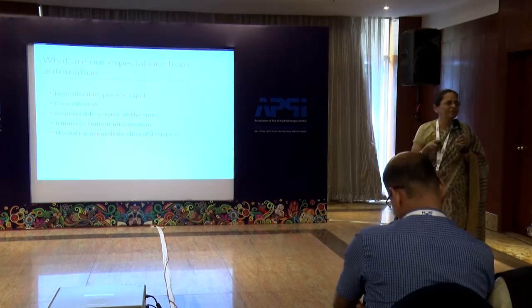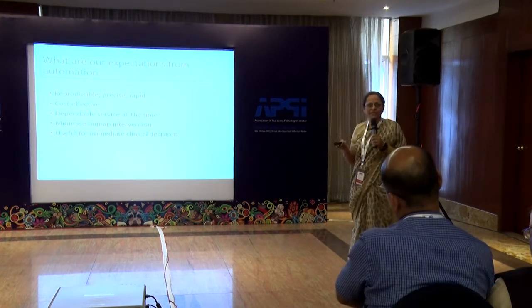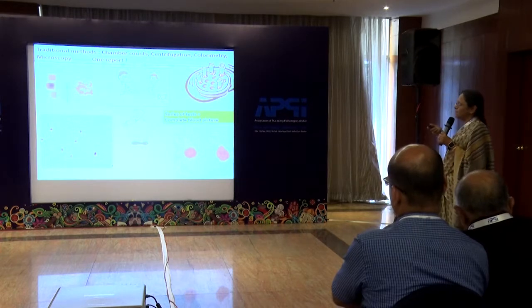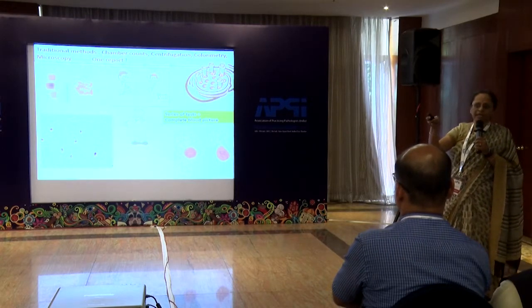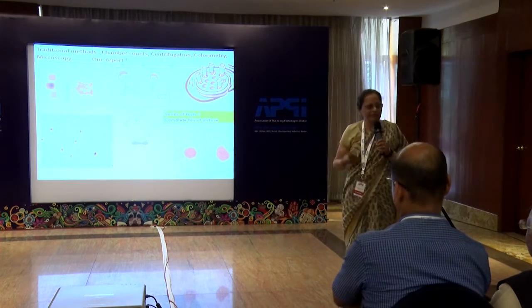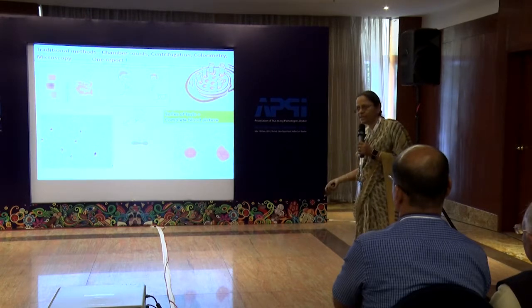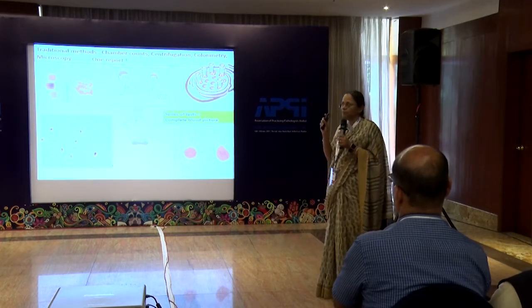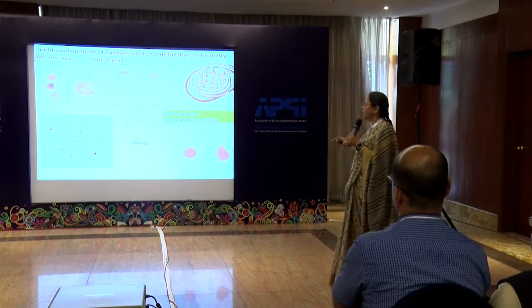We are trying increasingly to minimize human intervention because of several factors involving manpower. So these are the expectations that we have from the laboratory when we have automated cell counting. The traditional methods had several steps to generate one report that we all now sign out. If you had to sign out one sheet, it had multiple values, and each of them had a different method, different requirement, different skill. So you had to do hemoglobin, PCV, WBC count, you had to make a smear, stain a smear, do microscopy, you have to have a good Neubauer chamber, which is dependable, and somebody who is good at counting in a Neubauer chamber to generate that one report. And it actually meant a series of tests.